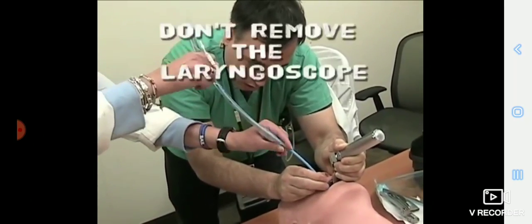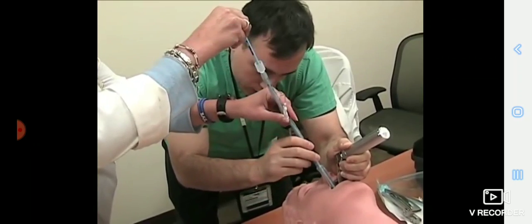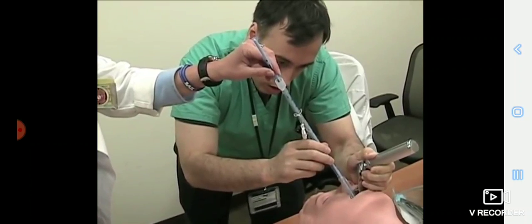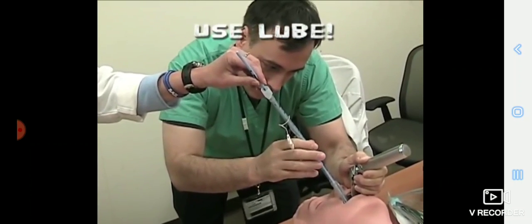You want to leave the laryngoscope in the mouth to keep those posterior pharyngeal structures from collapsing on your bougie. So you have an assistant place the tube over the bougie, hold the top of the bougie, and this now allows you to advance the endotracheal tube through the cords.